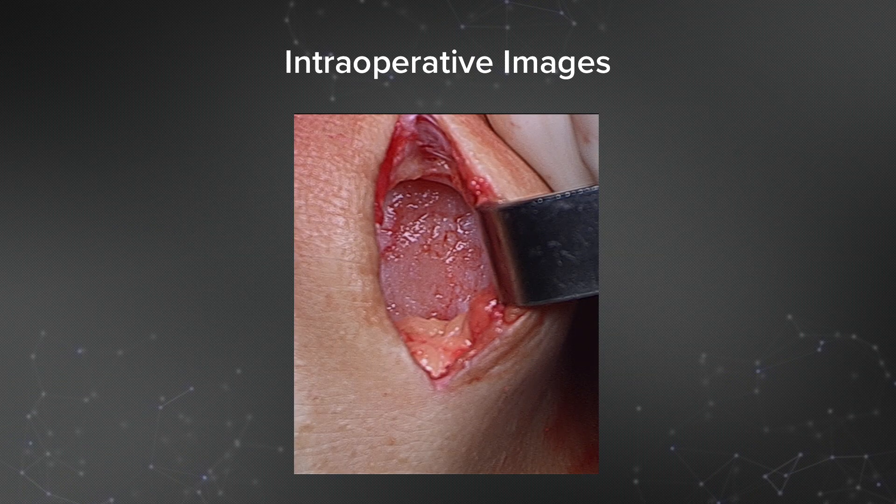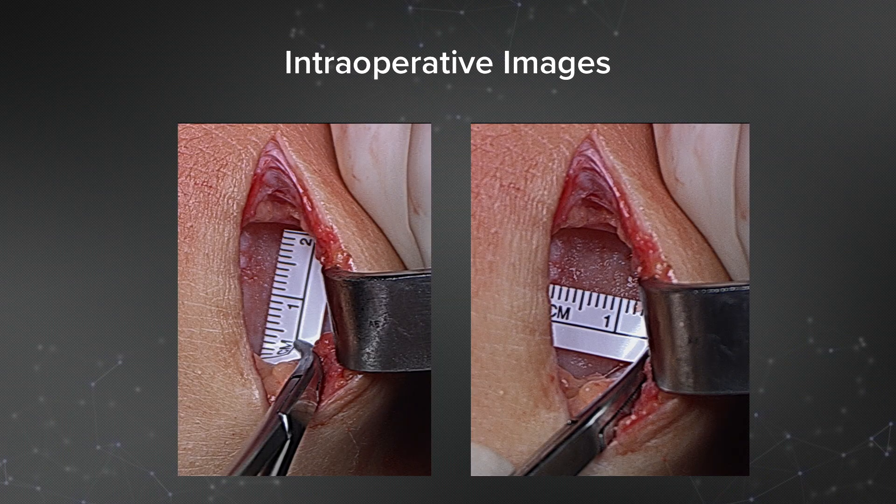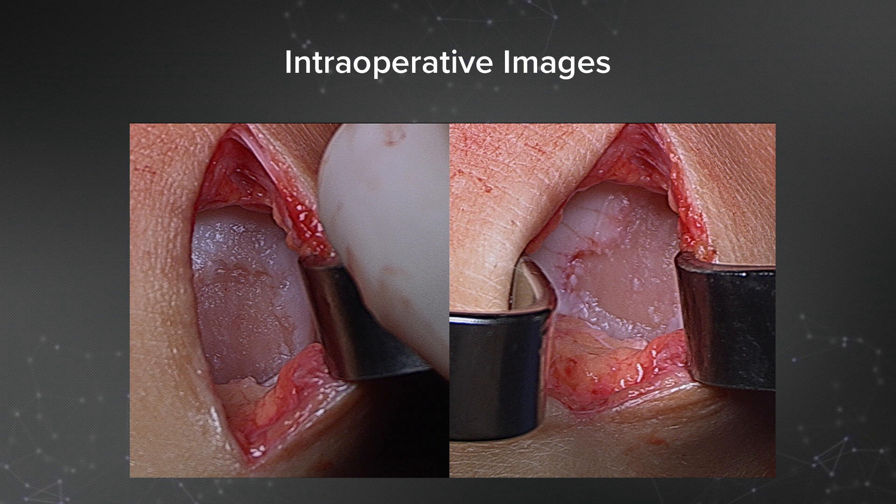This is the arthrotomy. I made it simply by extending the anterolateral portal, making it as long as needed to visualize the lesion. I then use a ruler to measure the lesion — this one measures approximately 1.5 by 1.5 centimeters, superior to inferior and medial to lateral. Here's a close-up view of the actual lesion. It's not perfectly circular or oval; however, I am going to use a ring curette to sharply create a border between the normal cartilage and the bone.